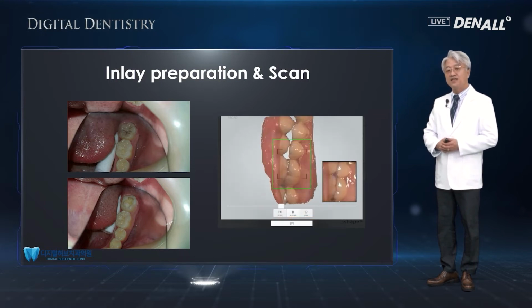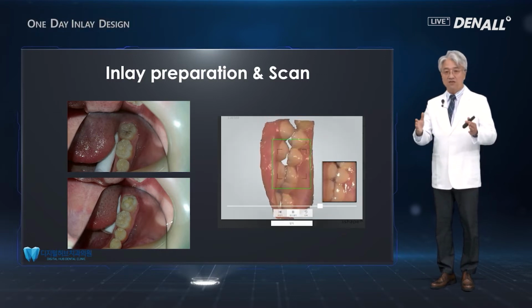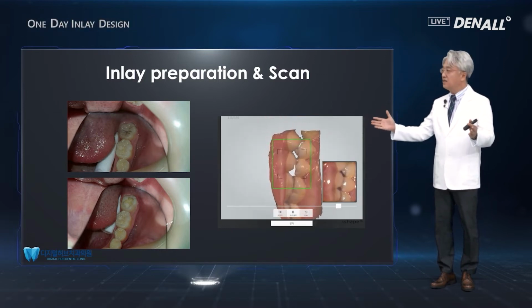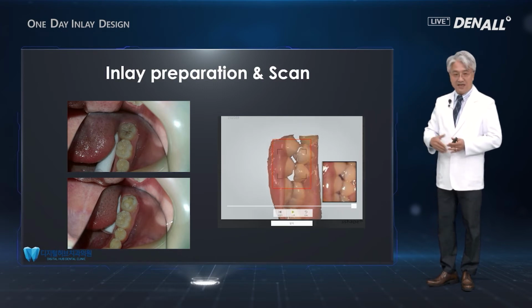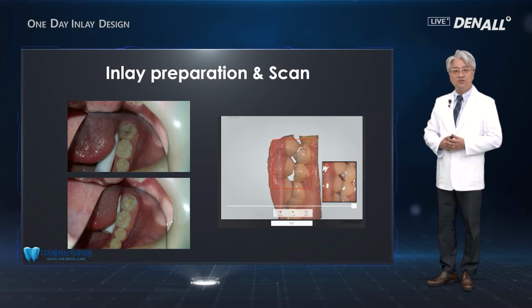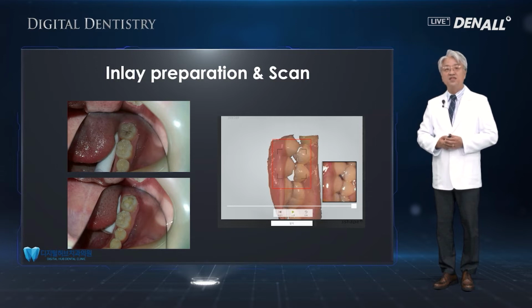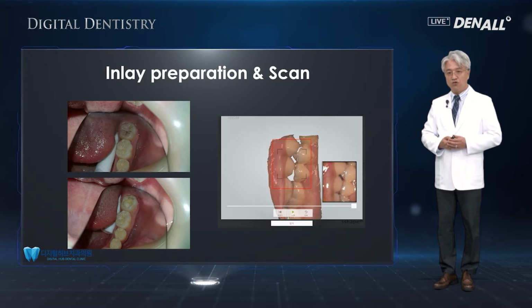So if you are using the CAD-CAM for the first time, then rather than doing other treatments, it's easiest in terms of scanning. It's better to start with the inlay. So the CAD-CAM solution with the one-day concept is very feasible and easy to do compared to others.